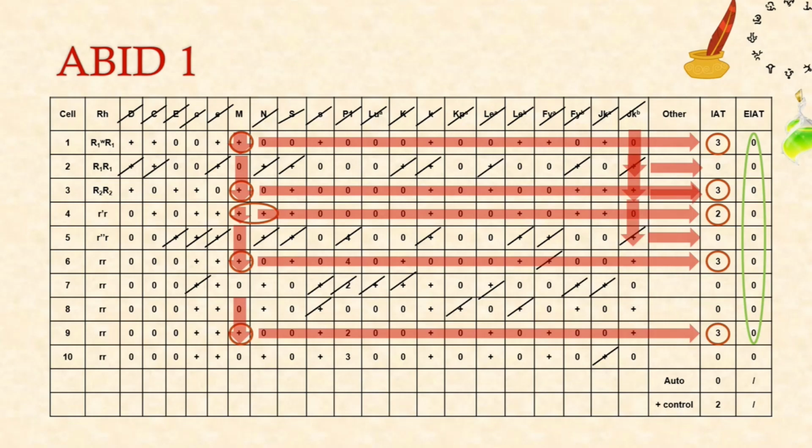It's not a heterozygous, it's not JKB cell, so I can exclude it using this because it's a homozygous JKB cell, but I just like to go on and do a little bit more. So just move on to the next one, move along. That's positive there, so I can't exclude it, so I've got to move on to my next positive. Down we go, move it along. Great, that's negative. Strike through, then it's done.